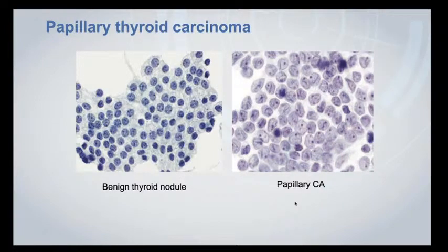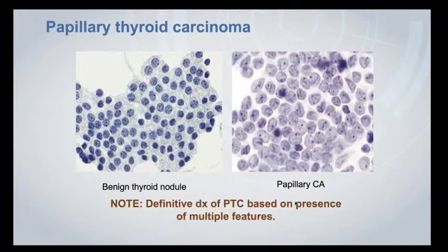Again, here's that side-by-side image, and it allows me to make perhaps one important observation, and that is you really should avoid making a diagnosis of papillary carcinoma on just a single criterion. The diagnosis of a malignancy here is based on a multiplicity of criteria, not just a single feature, but I can't tell you how many criteria you have to have. I'm often asked that question, and sadly, there is no answer.